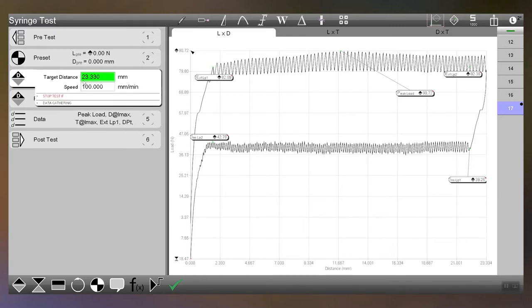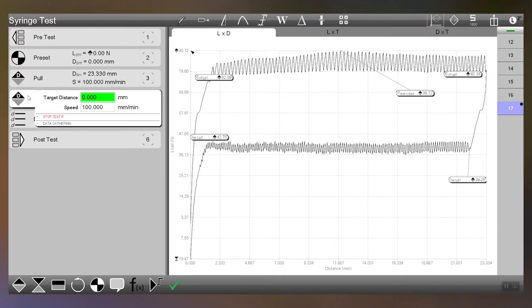So for our first point we're going to pull to 23.33 millimeters at 100 millimeters a minute and when we get there we're going to return back to 0 millimeters at 100 millimeters a minute.